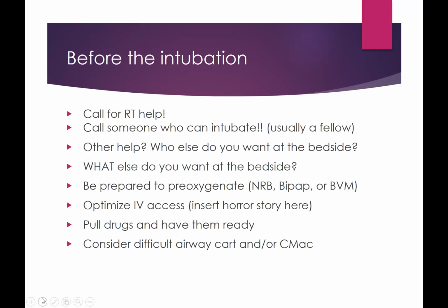Am I prepared to pre-oxygenate? Do I have IV access? Do I have the medications? And the physician will usually tell you exactly what they want. If you are in a department where you happen to have a CMAC, or the area I work in has a difficult airway cart that has all of the equipment we would need in a difficult airway.